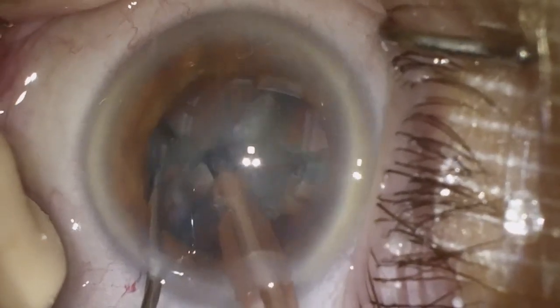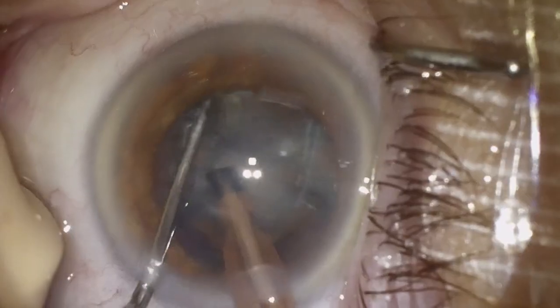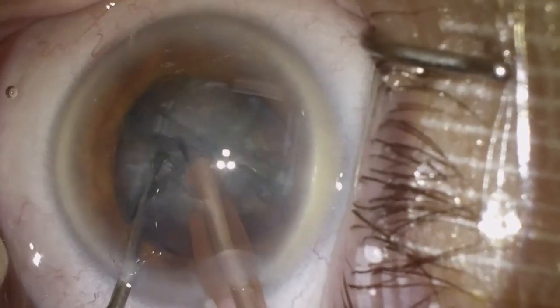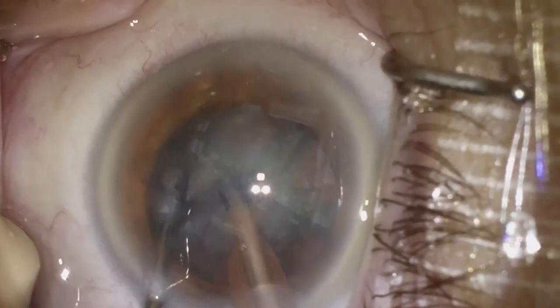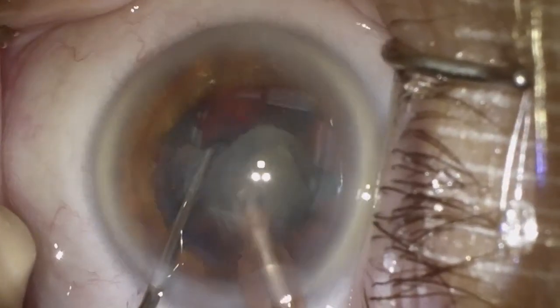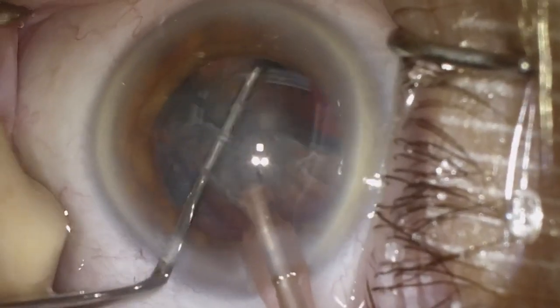And we can use our phaco probe now. Same mode. I don't change mode. I'm always in quadrant removal mode. And if I'm not getting good lift or good purchase, I'll go ahead and use my second instrument to extract that quadrant into the anterior chamber. The nucleus is a little bit on the denser side here, but nonetheless, we've got that first quadrant out. And we are making progress.